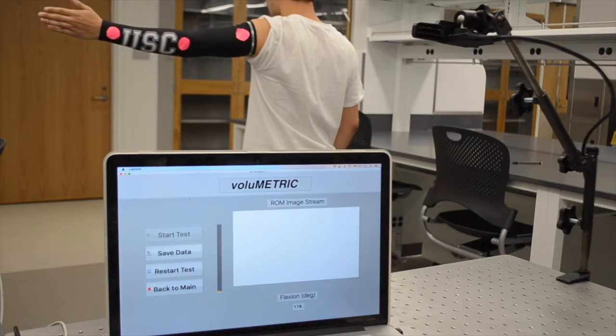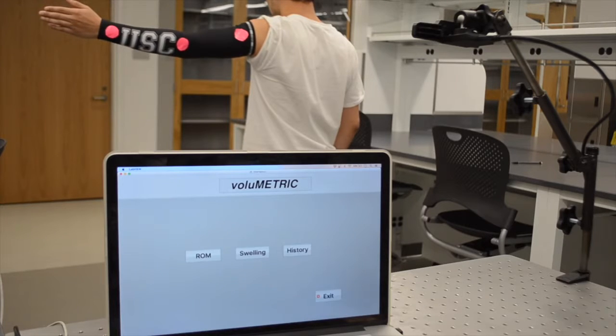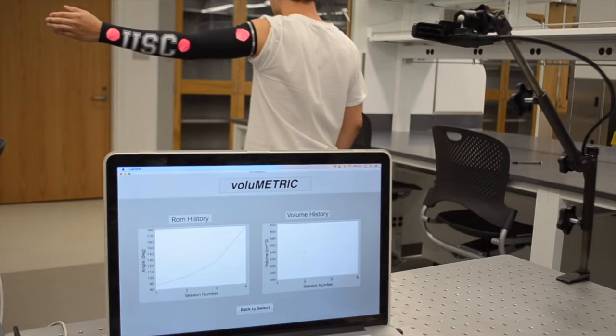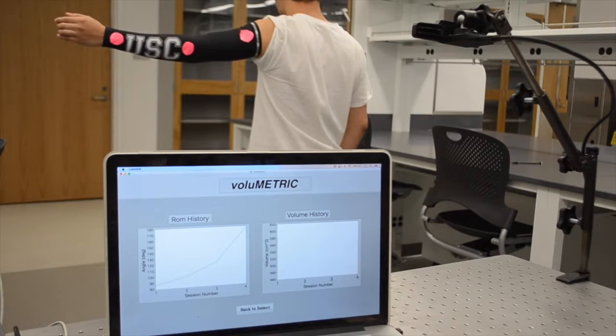The camera has now taken the image and selected the 3 dots that correspond to the indicators on his sleeve. Now we will save the data and go to view his previous data. Now, we can see that Carlos started off with a smaller than 90-degree range of motion for his arm. Over the course of therapy, in this case made up, we have sessions 2, 3, and 4, and finally this last session where he had a full 180 degrees of motion.